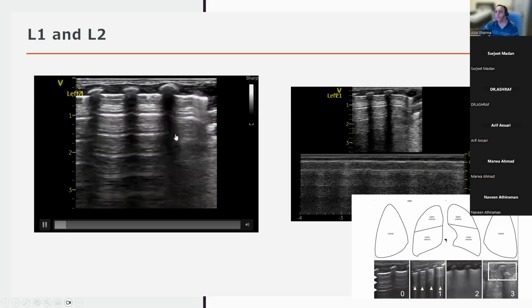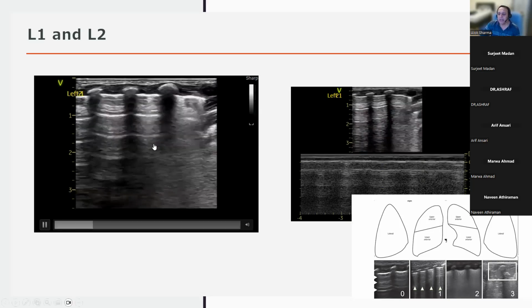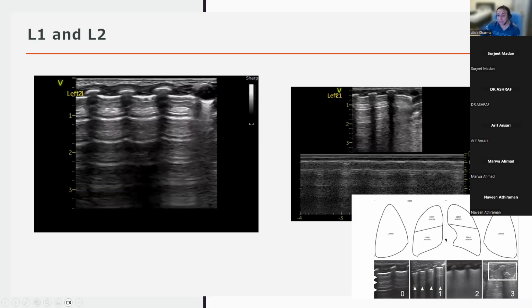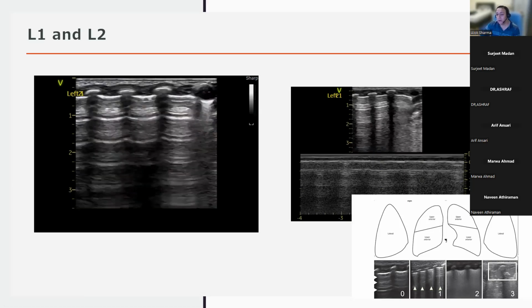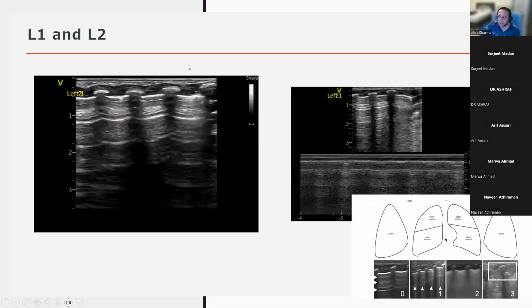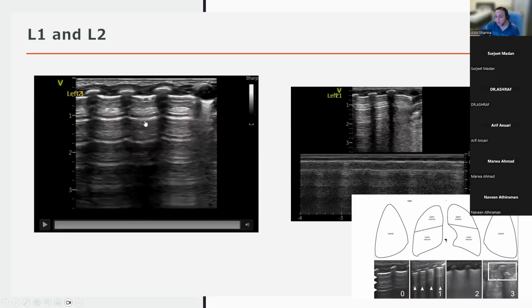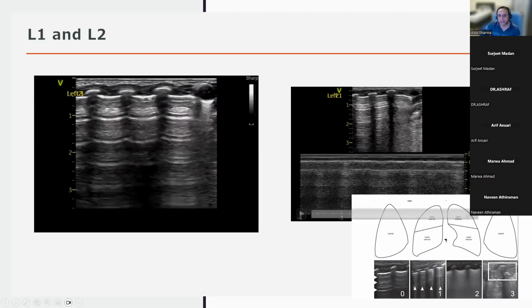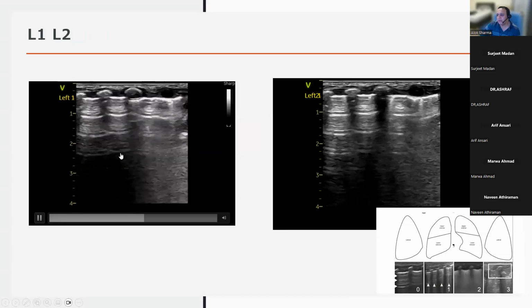Your probes will have variable frequencies. The probe that we commonly use is the linear or the hockey stick. If you're using a curvilinear probe, Dr. Babin Seva is going to share some cases with us on Thursday, and I strongly recommend that you don't miss Thursday's session, where she uses a curvilinear probe and her images are absolutely amazing. But for a linear probe, you'll have a range of frequencies. Your default frequency depends on your system. My probe defaults to 12, so naturally I'll see the superficial areas better, as is seen here. The deeper area is completely gone.